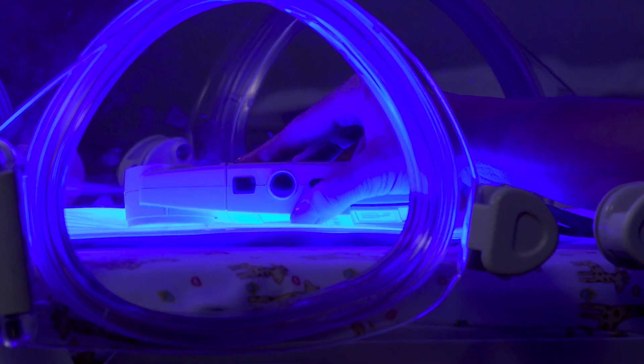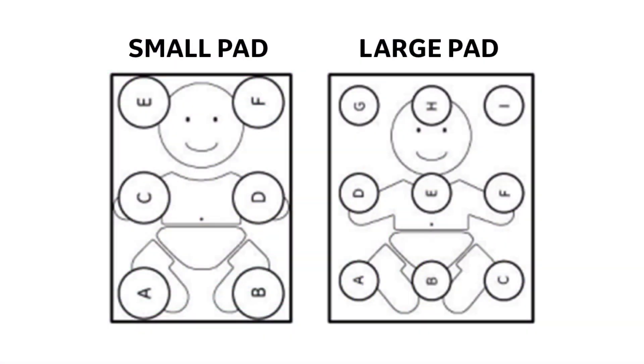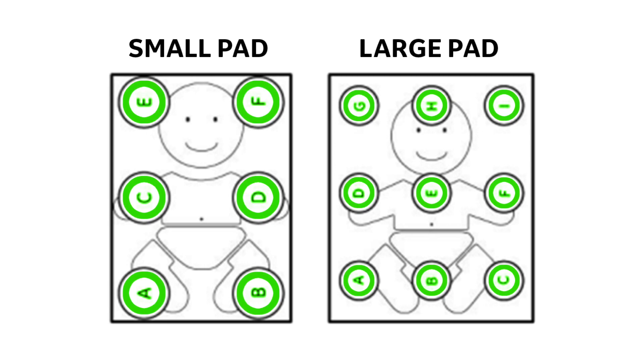I'm using the approved Omida Medical BillyBlanket meter 2. Take measurements on the lit side of the pad using the meter placed at points as shown on the back of the pad.